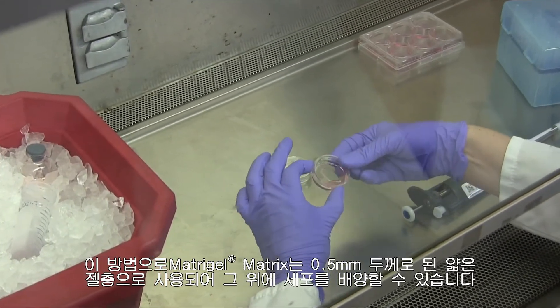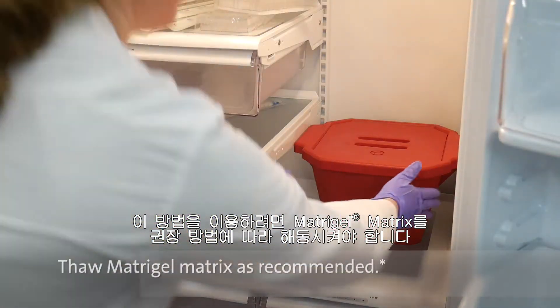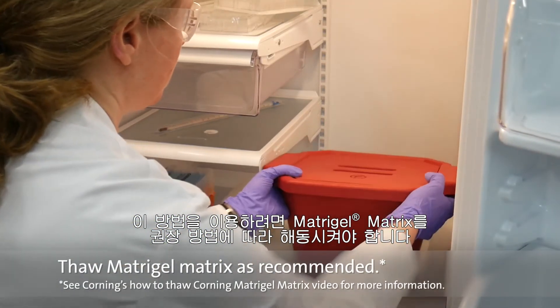Matrigel Matrix may be used as a thin gel layer, 0.5 millimeters, with cells plated on top. To use this method, thaw the Matrigel Matrix as recommended.